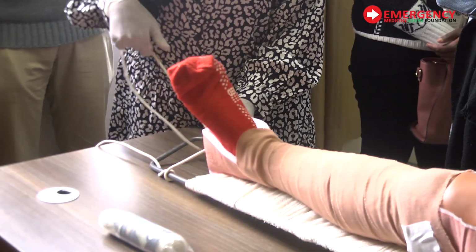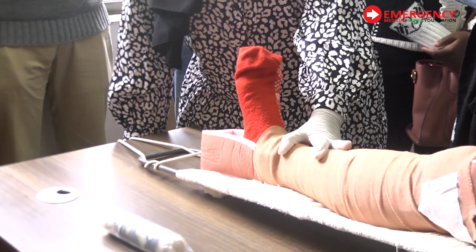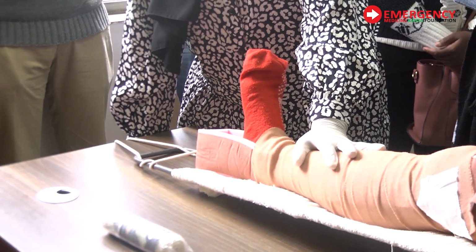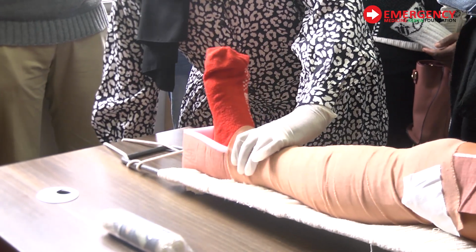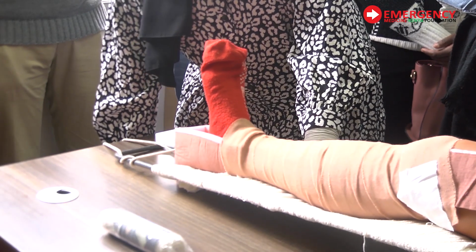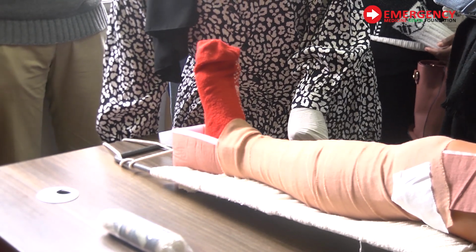And then you put it like this, and then you attach your pulley down here. So basically, they normally say, is it 10% of the body weight? You can put the pulley. That's what you can do. So it's 80 kgs, 8%, it's 8. So you put 8, so that you have very good traction. Okay, so you'll see the leg actually pulled. He'll feel a bit of discomfort, but you've already given a block or whatever it is, so the limb is going to be secured. Understood?